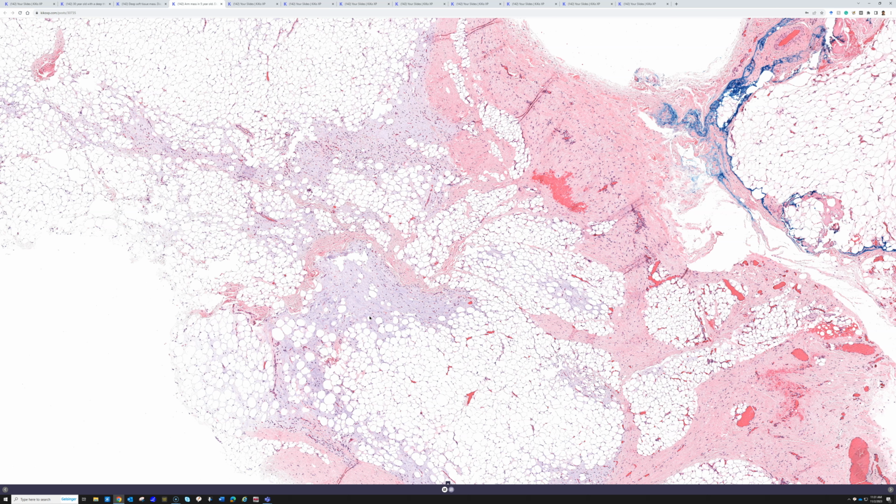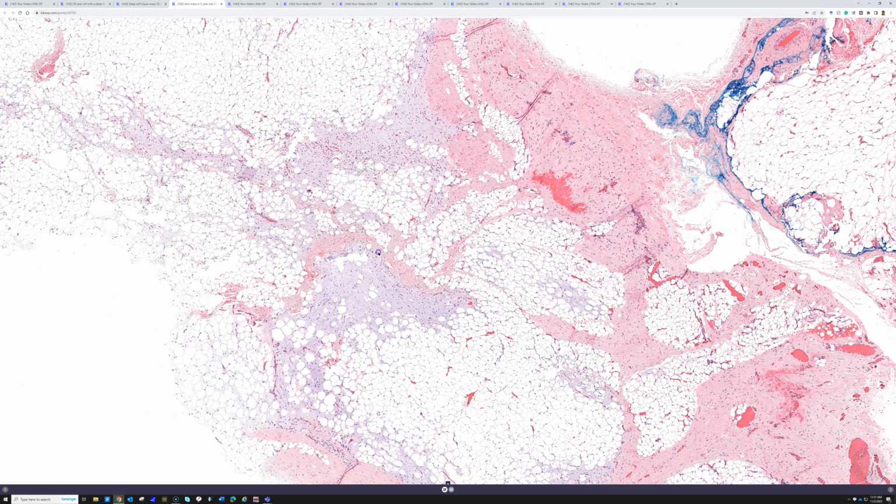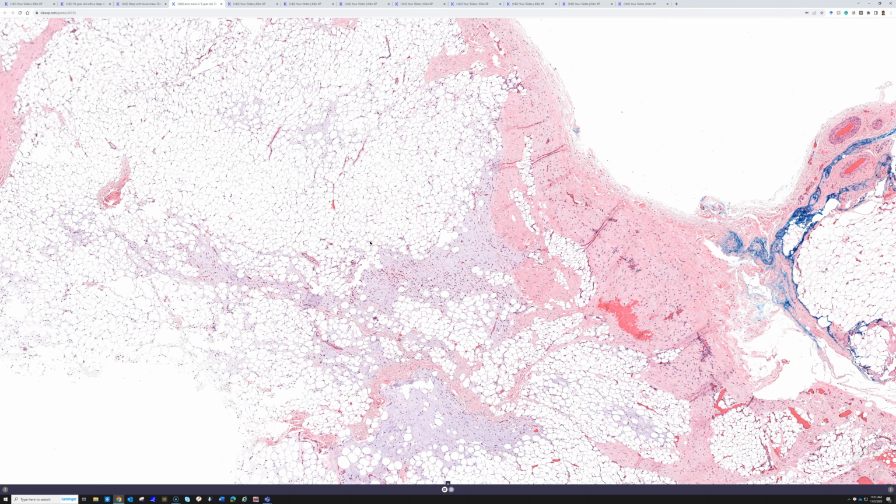And then in lipoblastoma, the tumor we're seeing here, what you get is rearrangements or fusions of the gene PLAG1, P-L-A-G-1. That's the same gene that's involved in pleomorphic adenomas of the salivary gland. So molecular is strange like that, and always kind of baffles my mind how you can have the same gene or even sometimes the same exact gene abnormality in totally different and unrelated tumors.